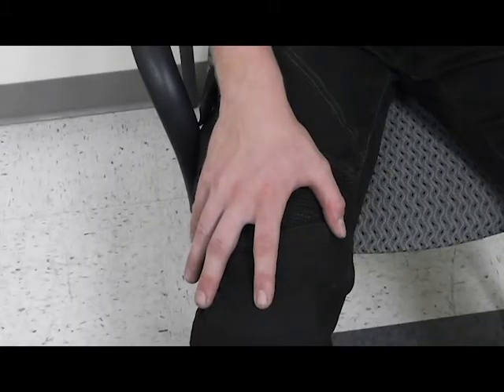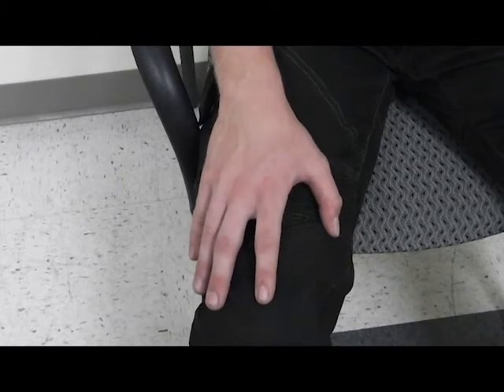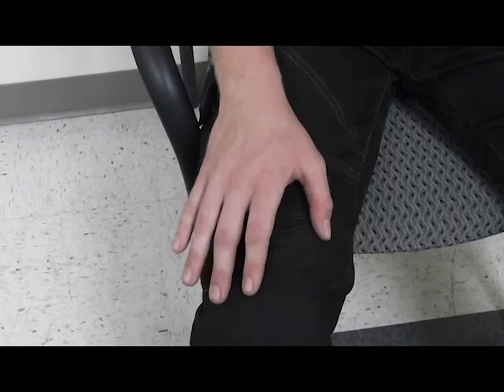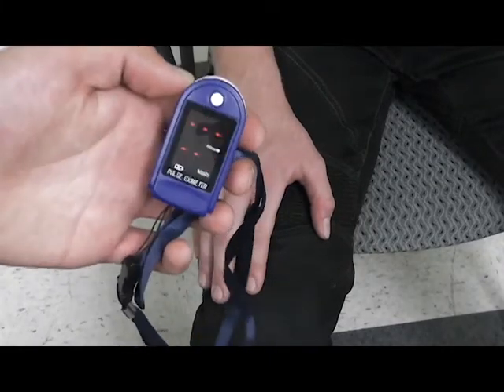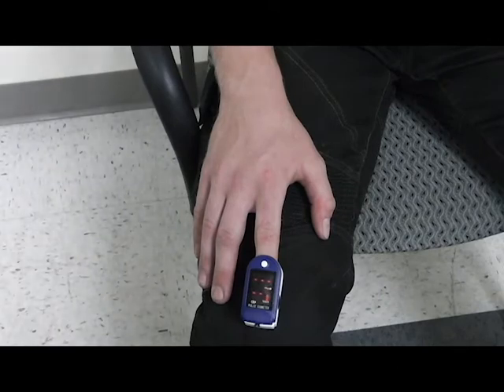This is a demonstration of taking a sat using an O2 sat monitor for a patient. First, make sure your patient's hands are dry and clean. If your patient does have nail polish on, this will not work and you'll have to use alternative methods. Take your sat monitor, make sure that it works, then place it on the index finger and allow it to read — it's going to take a few seconds. Once you obtain your sat, record it. In this case, he has a sat of 96 to 97, which is pretty good.